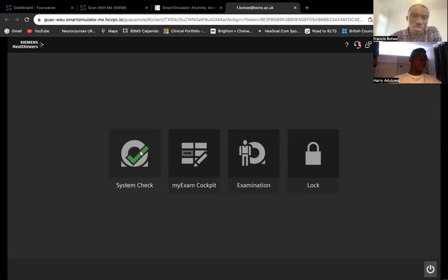When you go to a well-organized department early in the morning, you have to run your QA systems to be sure that everything is running optimally before you proceed. If there's an error message or the system is not okay, you don't go ahead and scan, because the result you produce might not be good. It's not reliable.